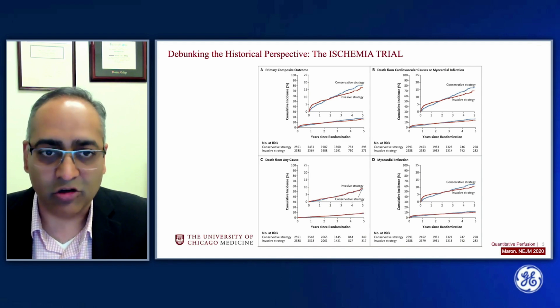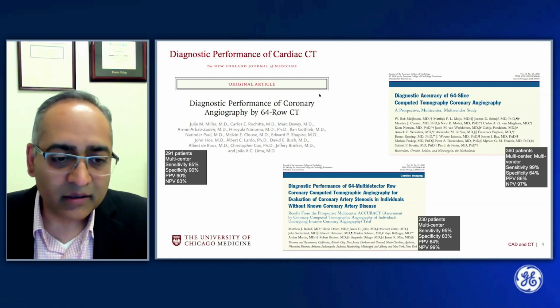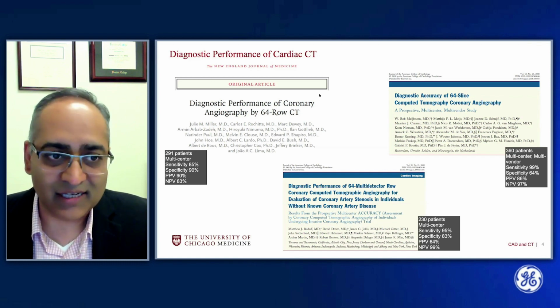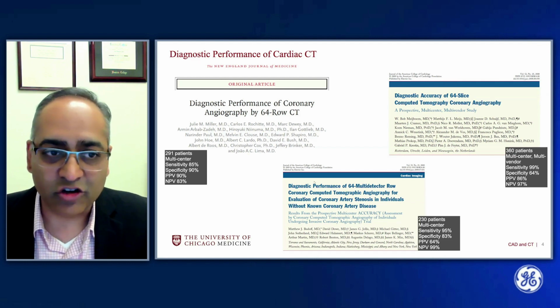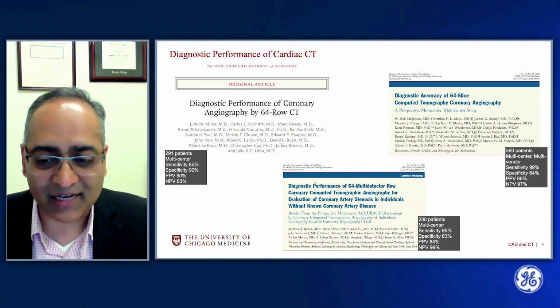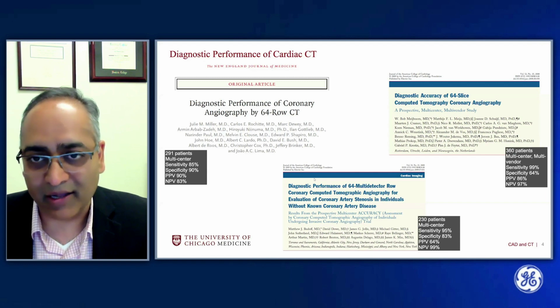Now, cardiac CT has been around for nearly 20 years and has been extensively studied and validated. Here are just three of the larger initial multi-center studies validating the diagnostic performance of cardiac CT. As you can see, the negative predictive value is excellent, as is the overall diagnostic performance when compared against invasive coronary angiography.